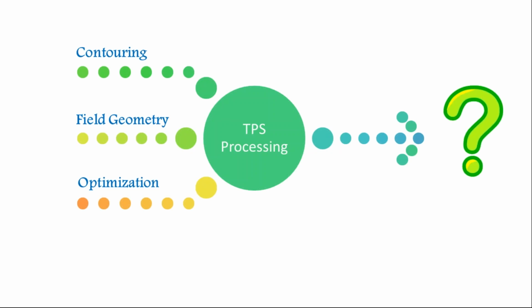We need to know exactly how to contour the organs at risk, how to contour the target itself, whether it's SIB or not. So we need a deep understanding of our structures: the target, PTV, as well as the organs at risk, and where these organs at risk are located with respect to the target.